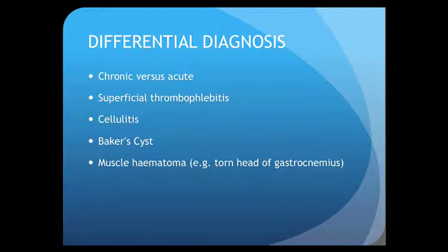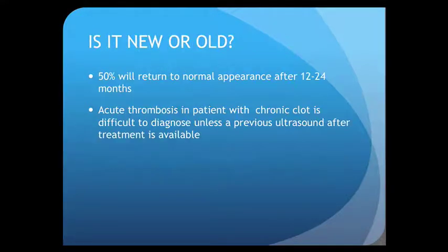So, when we see this, what else are we looking for? What's the appearance of some of the other causes of the swollen and tender leg? Well, the first thing is, if you see a clot, you have to consider, is it new or is it old? So particularly in the patient who says they have had a previous clot, this can become very difficult.